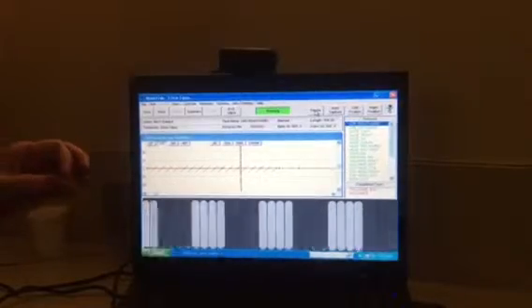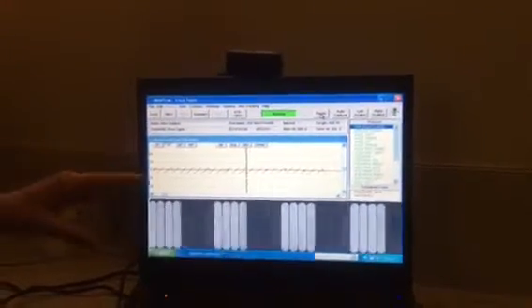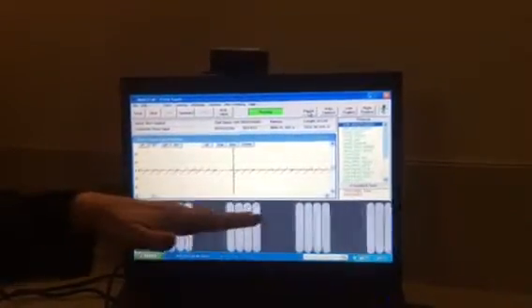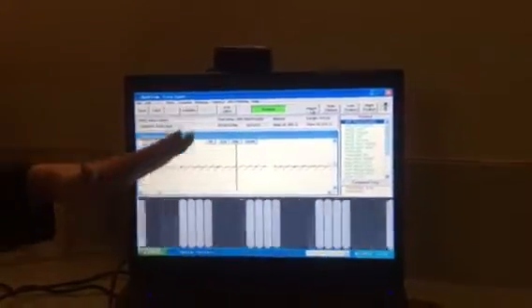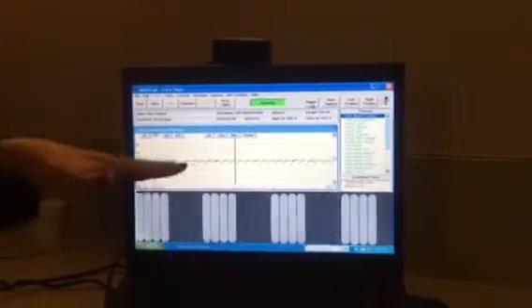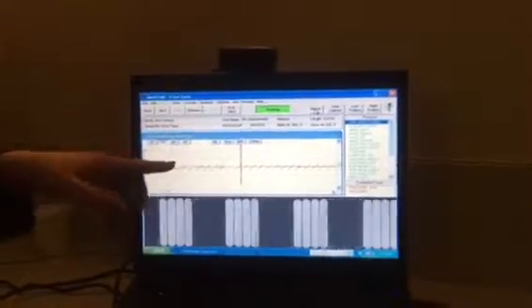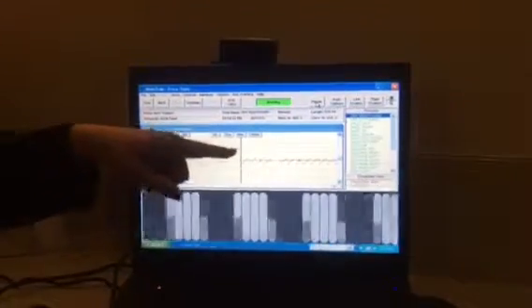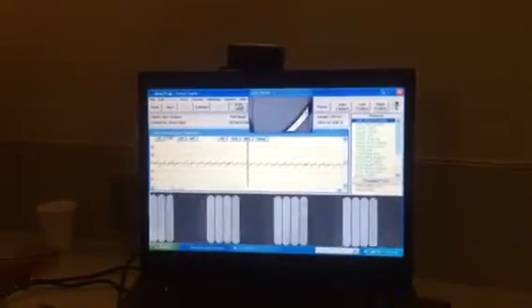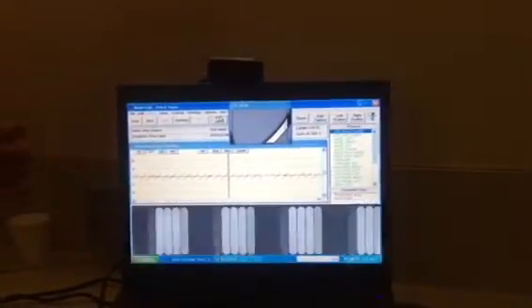This is called OPK. The OPK is optokinetic. Your eyes are moving to the right, and you are making sure that the patient is looking at the computer, at the zebra stripes, and not at the screen. The way you know that is that these lines will be very similar to the black lines. You can also bring up the eye view so you can see the eye bouncing. The eye has to bounce during this test. You want the eye to bounce, especially in the opposite direction.